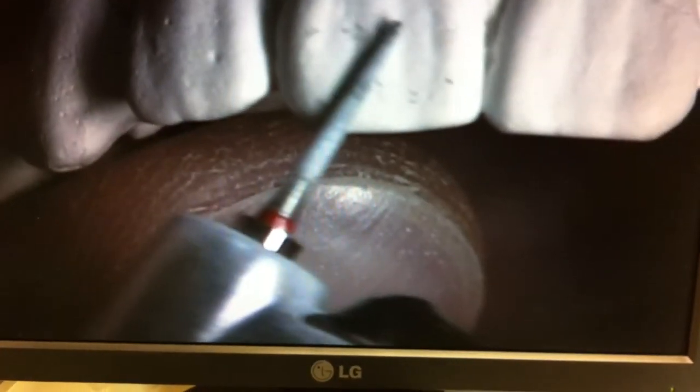When you get to that valley area, I'm going like this, and then I'm going like this to make this pointy. Then I'm going like that, like that. When I get to this area where I have the valley, then from this view you'll see better. I will change the position of the burr and I'll go over the transition between the pink color and the yellow color. So here I need to create a little depression over here, not on the mesial. There's none on the mesial. Which is the same thing you do on the lateral.